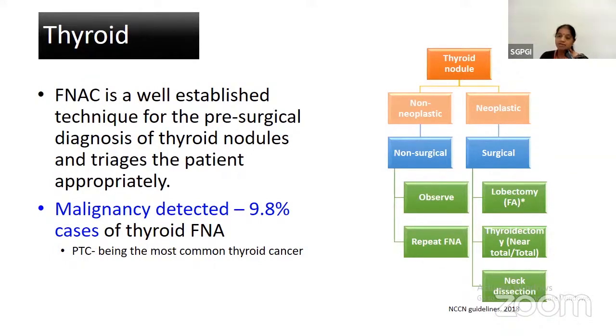So here it is. We know that it's a well-established technique for the pre-surgical diagnosis, and it helps triage the patient appropriately. So our job is to tell them, is it neoplastic? Is it non-neoplastic?